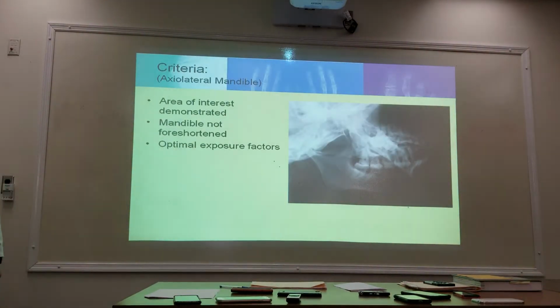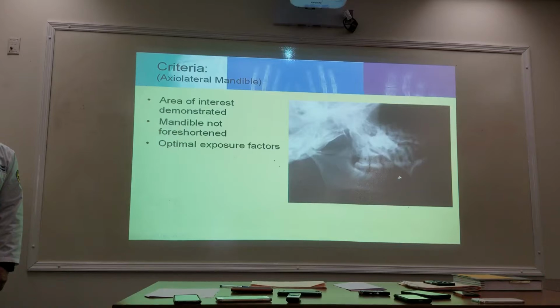All right. So here, what do we have here? Which one is this? 30 degrees? We're looking at this, huh? This is 30 degrees right here. So we're looking at the body. So the other part of the mandible is this. Here's the other mandible. The other half is going up this way.